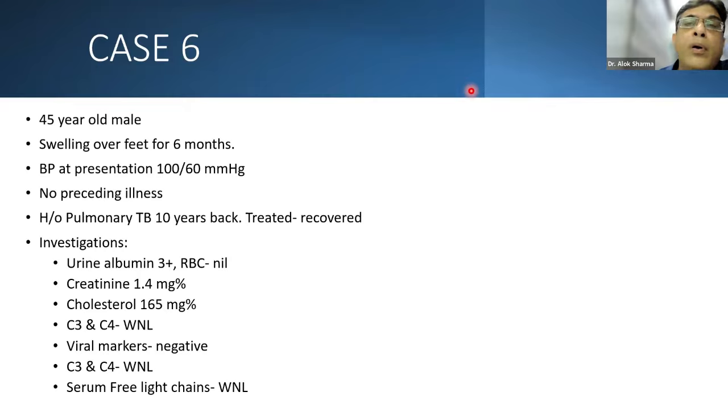Even if you don't do the actual examination, either you can keep that tissue or you can at least process it till the resin block stage. And whenever required, you can do an electron microscopy examination, because you cannot predict which case will require EM by looking at the clinical presentation or even the biopsy, right? Something which you cannot predict, you cannot even give a recommendation on. So ideally it should be done in all, but the recommendation is at least collect a sample for EM in all the cases wherever it is possible, right?